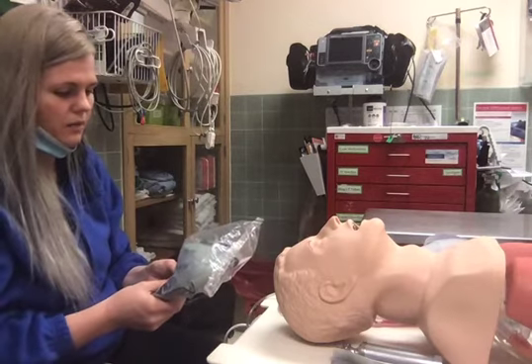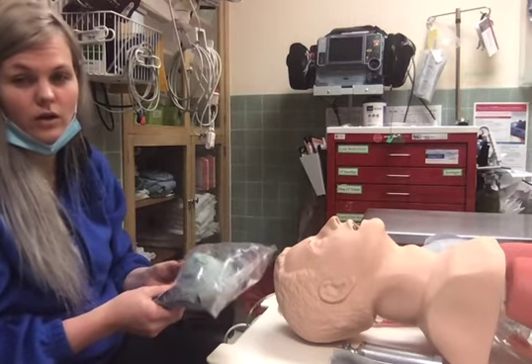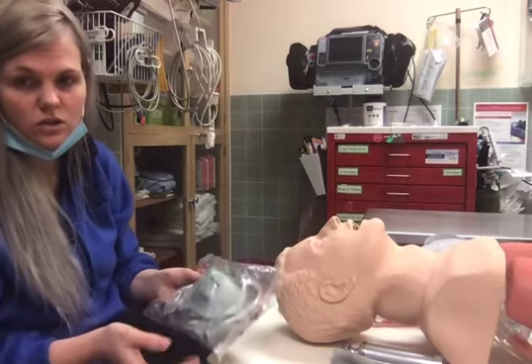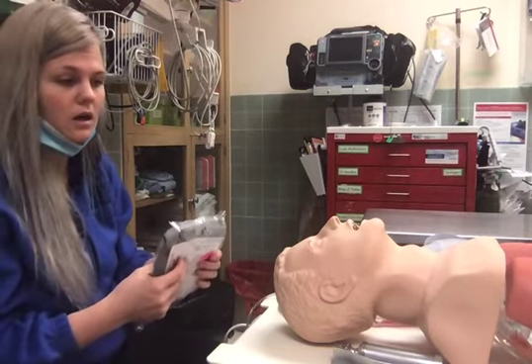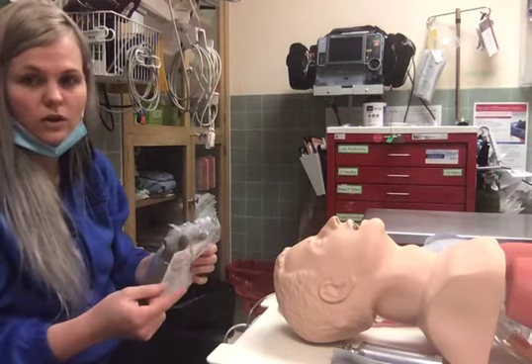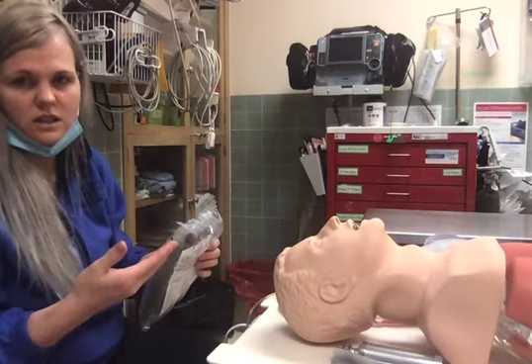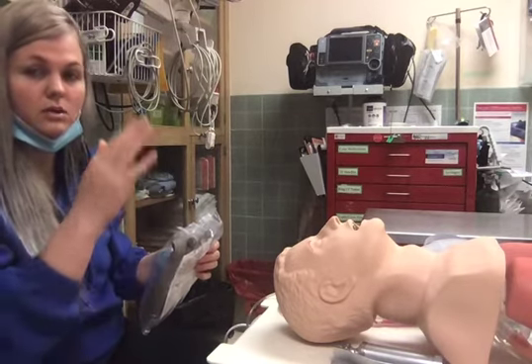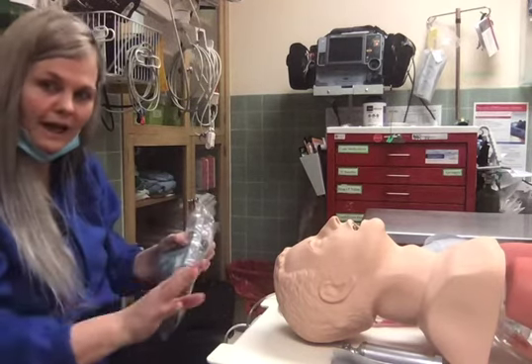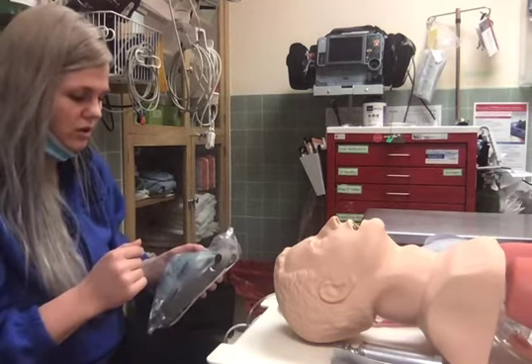This is a method used when you have that falling SpO2. They don't necessarily have a ventilation issue, but they may be having failing oxygenation issues. So when you start looking at heart failure, fluid in the lung, that type of thing, when you have that shunt sitting at the bottom of the lungs and they need some support on top to push that oxygen down in, or to push those fluids back into the capillary spaces so that exchange can happen, that's when you're going to be looking at this.